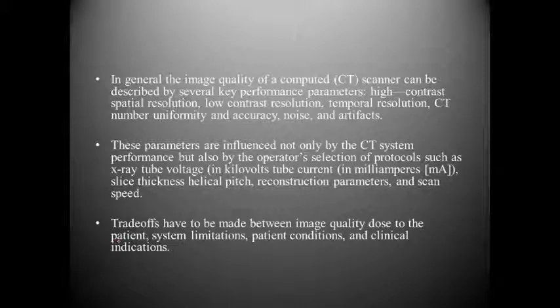And so you have to come up with compromises, what can be traded off so that you can actually acquire the scan and get as great of images as you can, but do it in a timely fashion. So that's something that has to always be in the back of your mind.